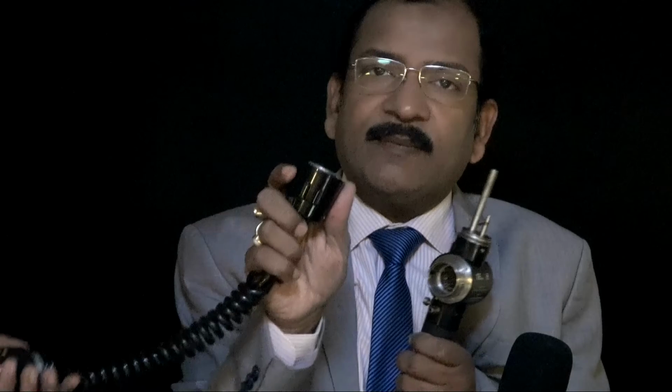Now this is called the male part of the pigtail adapter. This is the pigtail adapter. It is commonly called a pigtail adapter because it looks like the tail of a pig. And here you have the female part of the pigtail adapter, which you have to attach to the male part of the pigtail adapter. How to attach?